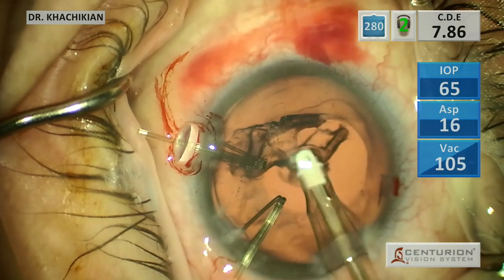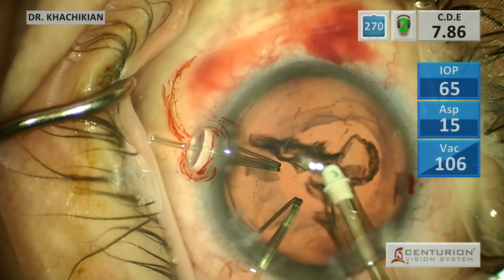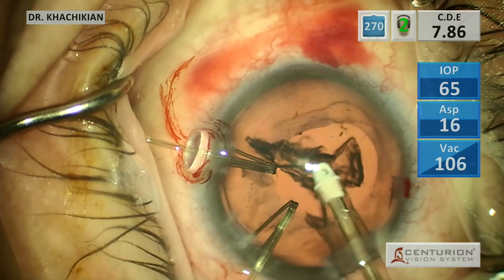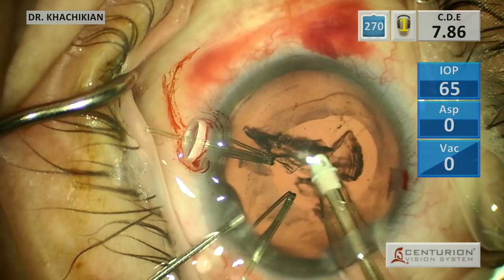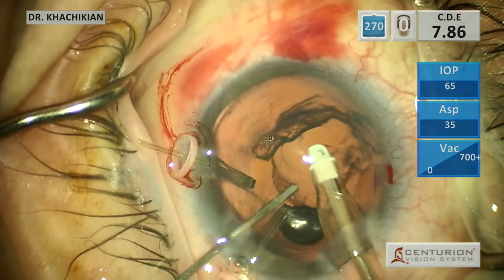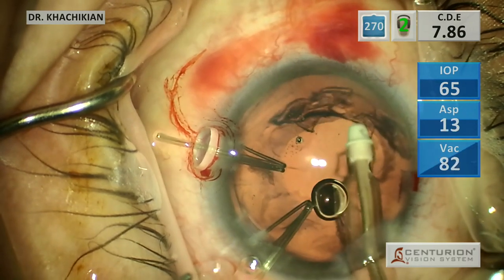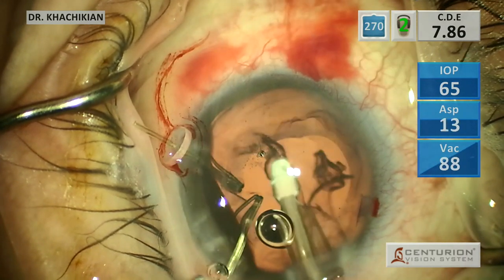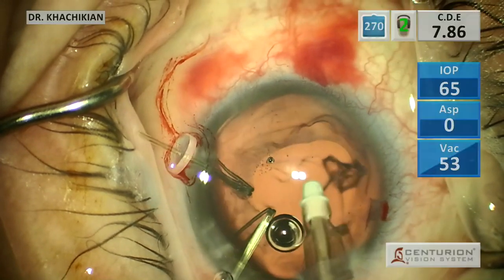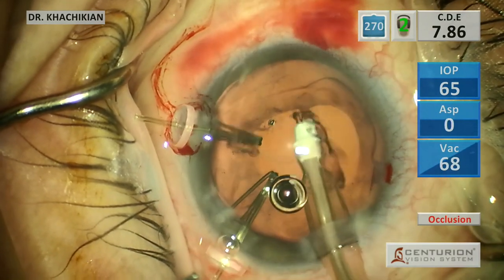We're getting it out slowly but surely. Could consider putting one more viscoelastic in - and that is what I do. More viscoelastic in, push the capsule back, grab the epinucleus cortical material right there. A little bit more, a little bit more - there it is. Awesome.